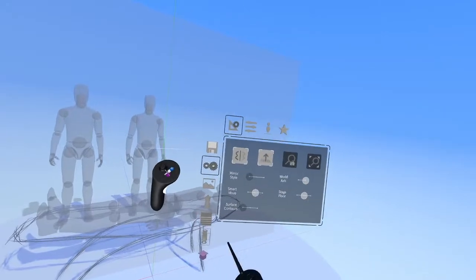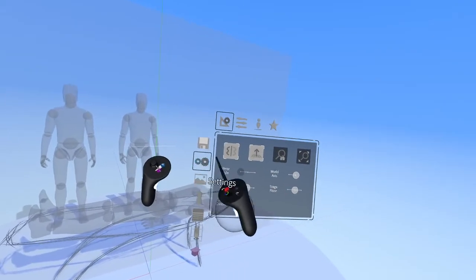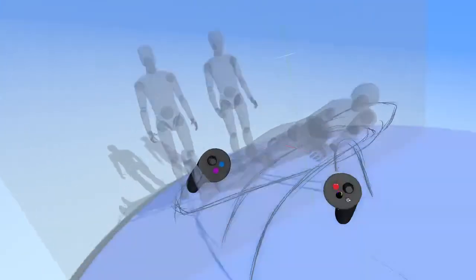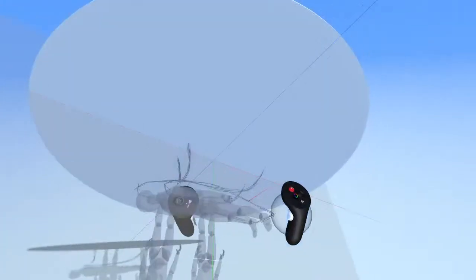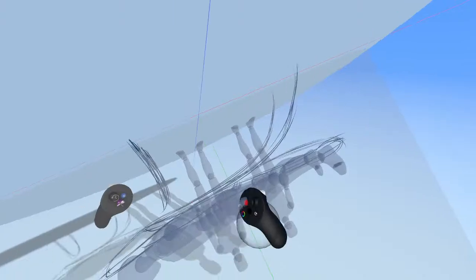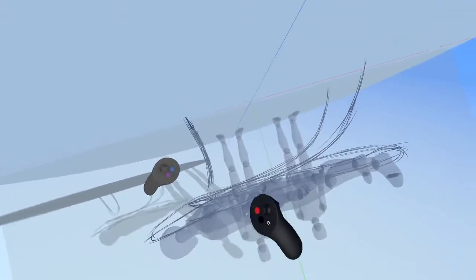So we can come in here to the blue menu button, go to settings, and turn off vertical lock. And once we turn off vertical lock, now I can position this so it's a little more comfortable. I can rotate it all the way around. And now I can come in here and very comfortably sketch the bottom side of this table.